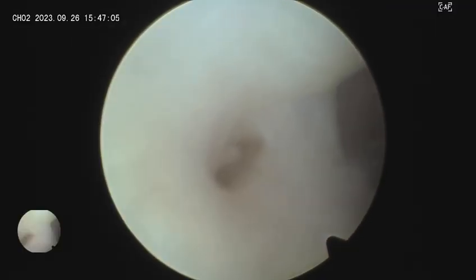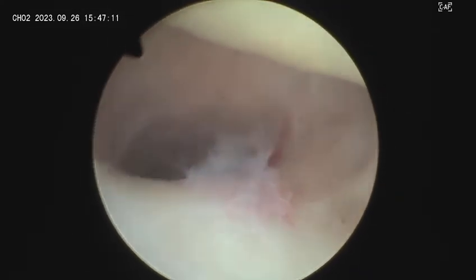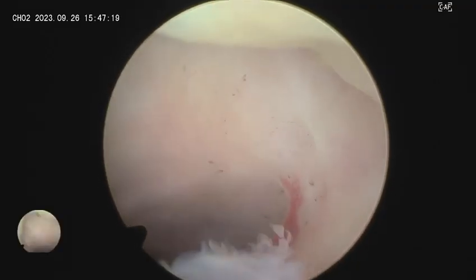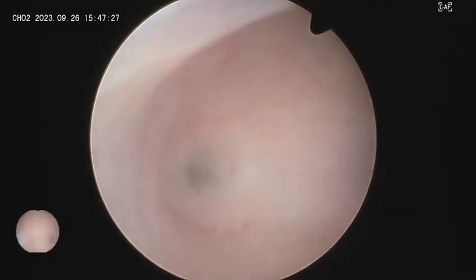So after clearing the chocolate material, you can see that there is an isthmoscele cavity at the site where there was a Caesarean scar previously done. Now this is the area which will have a cephalad and a caudal ridge, which is a fibrosed area, and the base of this isthmoscele will have an epithelialized portion which usually causes this kind of bleeding.